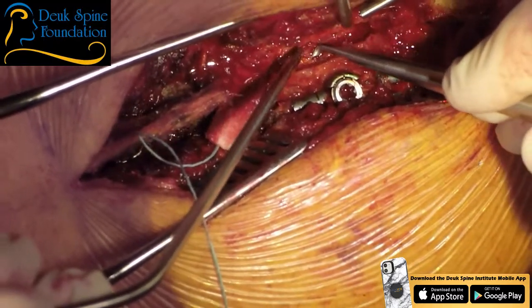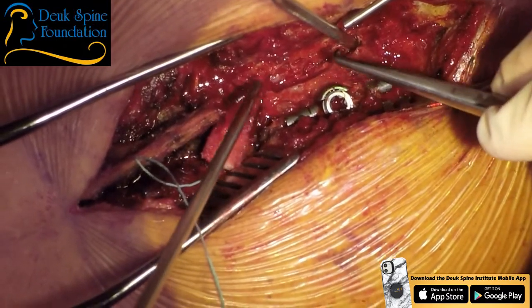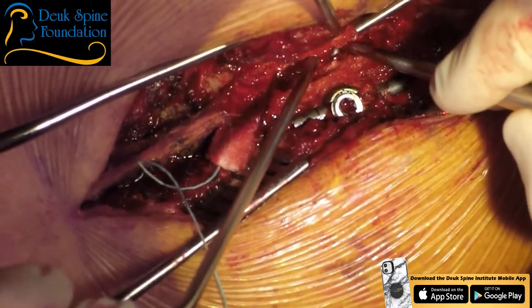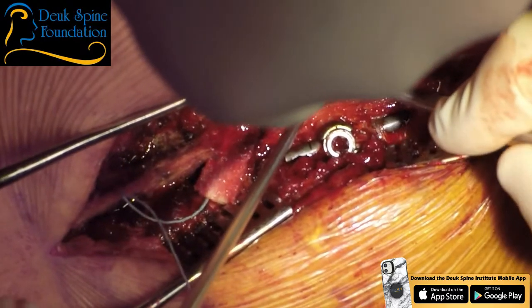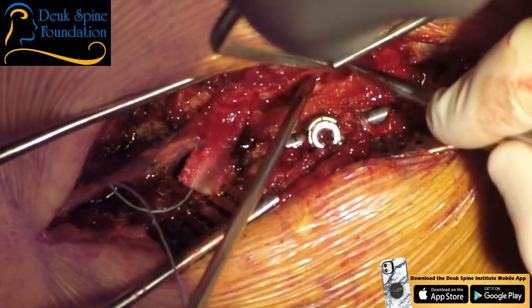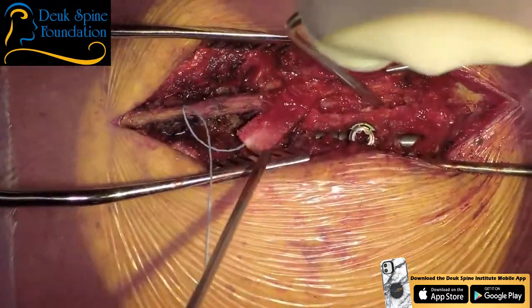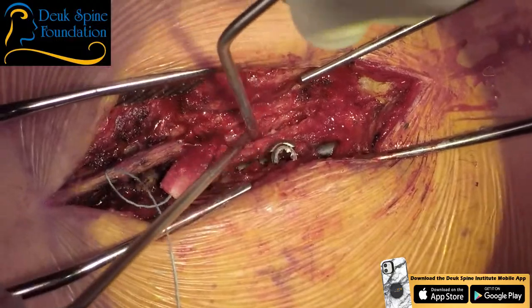Anyway, this is the thoracic spinal cord, and this is T11. So T11, some of T12, T10. T10, T11, T12. All right, beautiful. And again, it's just scarred down right here. You guys see okay, Sean? How good is the view? Yes. It's very good. I'm just underneath the facet. It's called the lateral recess. I'm just medial to the pedicle of 11. Well, I've gotten into some of T9. So T9, T10, T11, T12, just the top of T12.